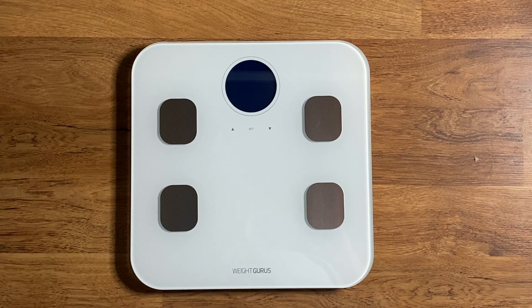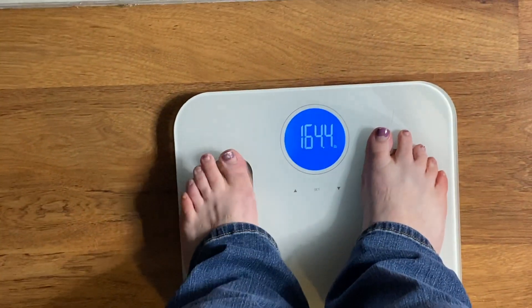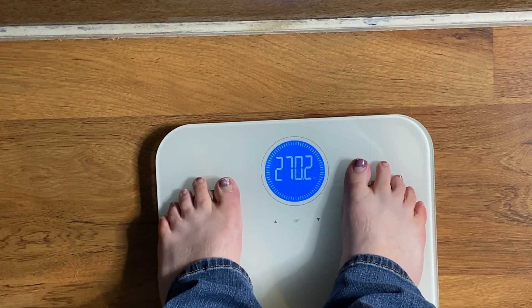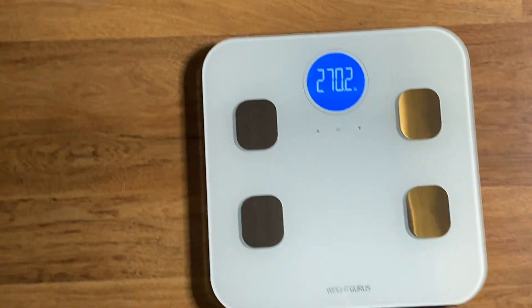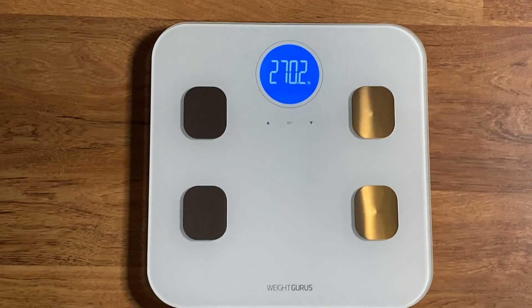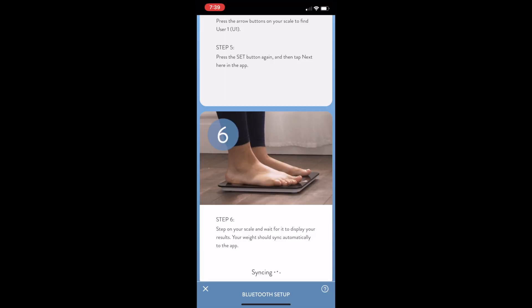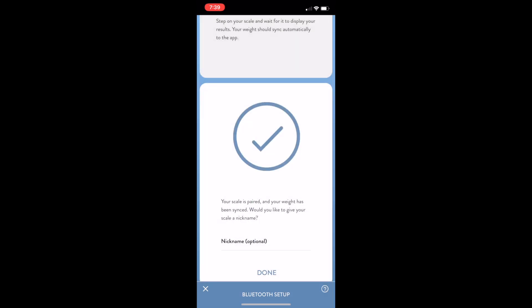Now it wants me to step on. Let's go ahead and do our initial weigh-in. You do have to weigh in barefoot, so keep that in mind. That's about what I expected after eating all day. This should now sync up to the app. It is syncing — there it goes. Setup is complete now. That was easy peasy.